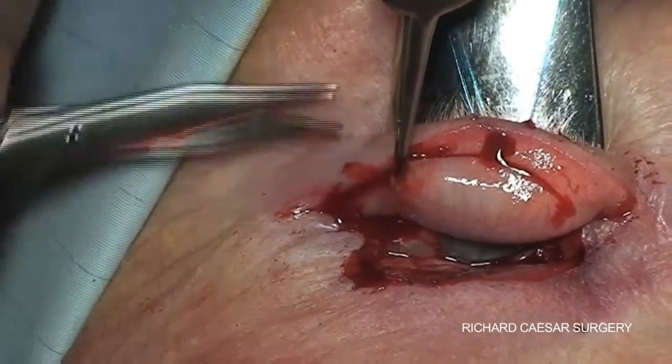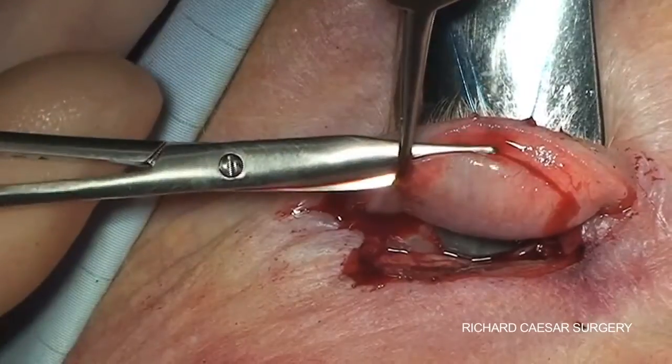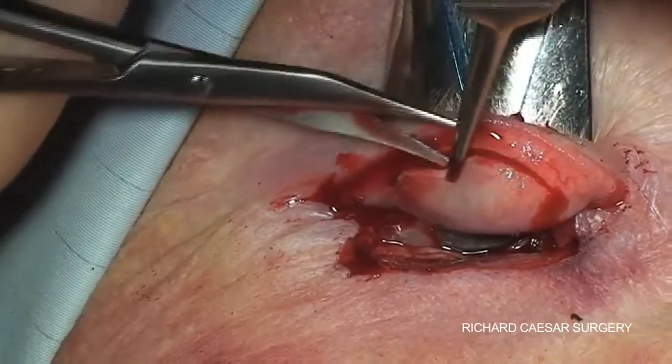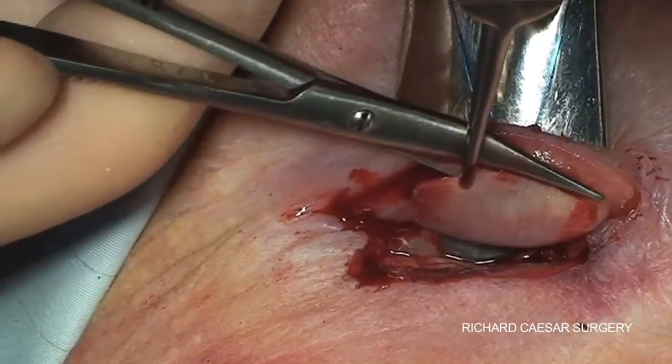In one or two cuts you can completely open up the first stage of the Hughes flap, with a minimum of trauma to any of the underlying tissues.